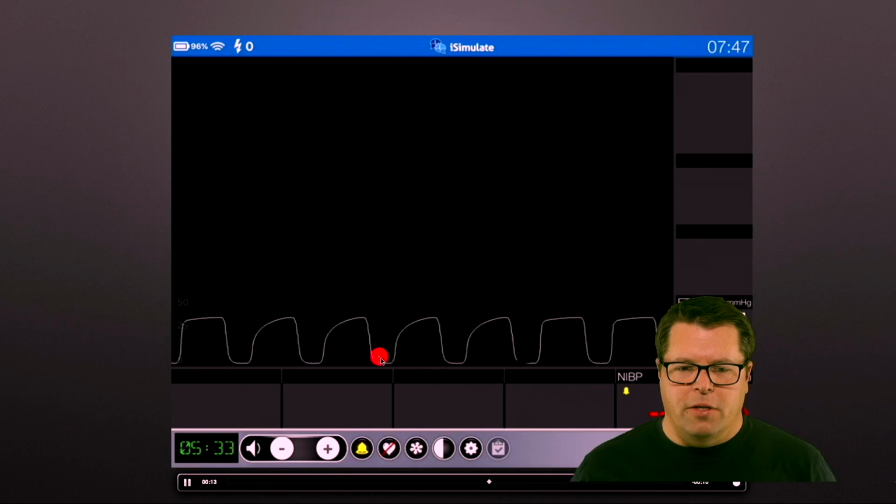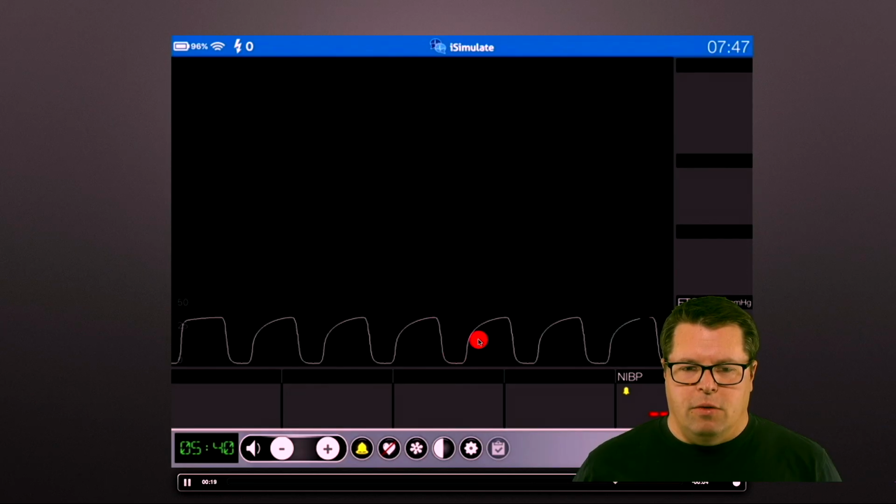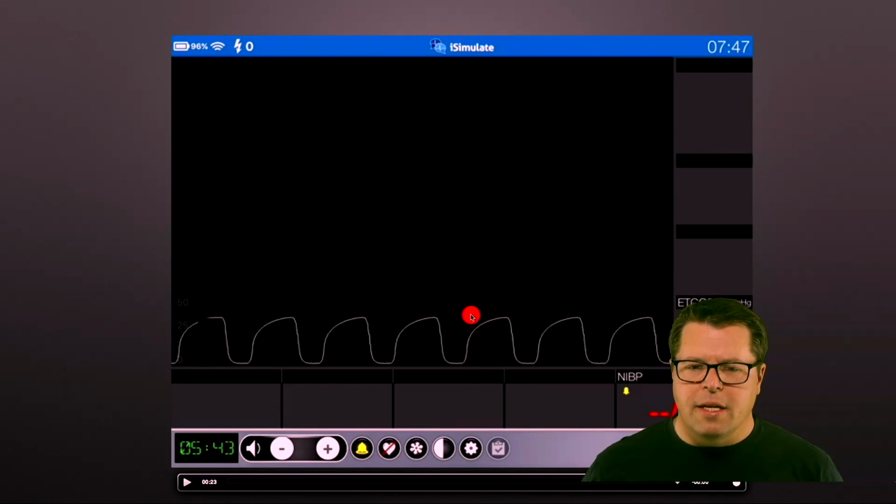So again, look at the parts of it. What's happening here? We are breathing in. End tidal CO2 goes across, it goes pretty quickly down to zero, exactly as you expect. But then as you start to breathe out, that number takes a minute to get to the top of the peak. It messes with your exhalation, whatever is going on here.